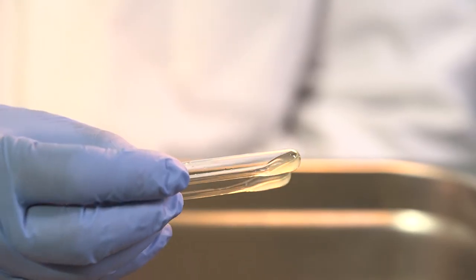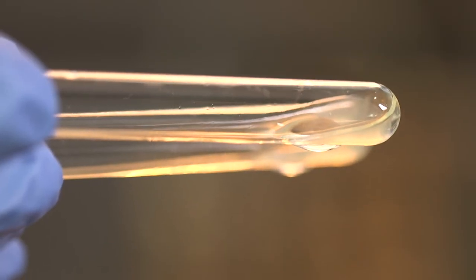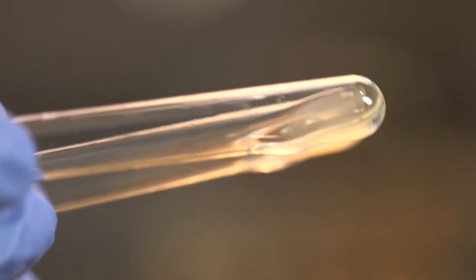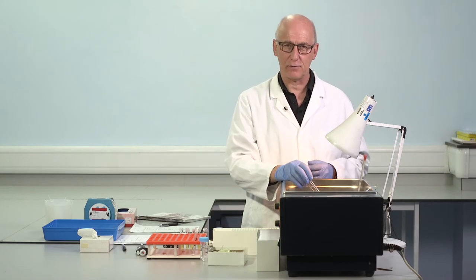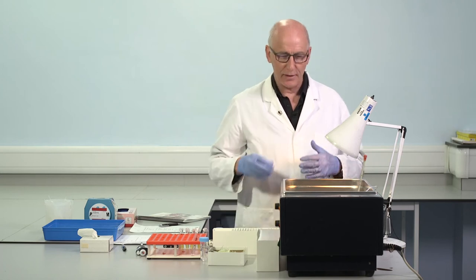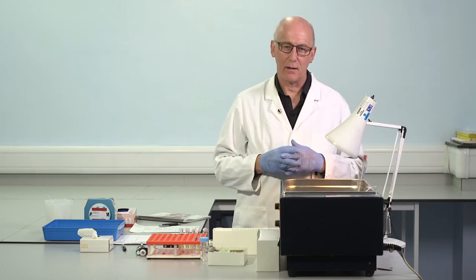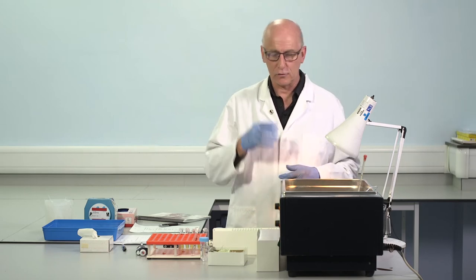This is the control, normal control. So we want to know, from this sample, for this QC material, which is the range that we expect? What's the target range of results? Is this inside our expected values? And for that, we need to refer to the target range that's already been established for this particular control.